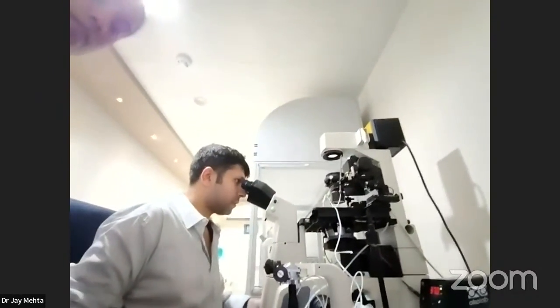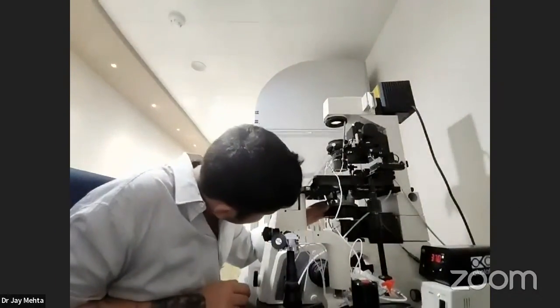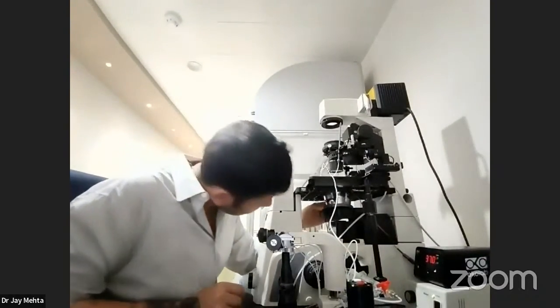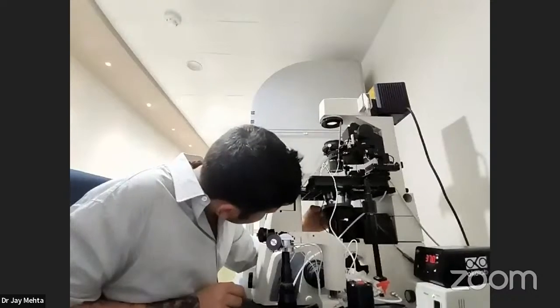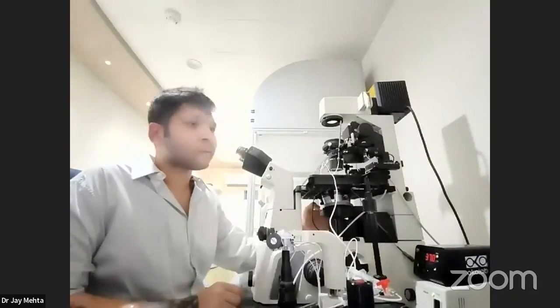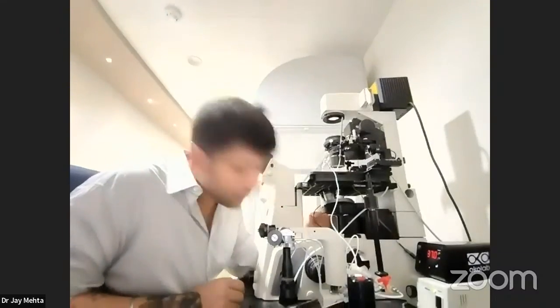As we all know how tough it is to deal with multiple pregnancies, and also the success rate of IVF clinics is now extremely important because of the competitive field that it is in. So if we select that one good embryo and transfer it, the chances of pregnancy, we expect it to be the best that we will be giving the patient without at the same time increasing the risk of multiple pregnancies. So over to you, sir, for your demonstration.